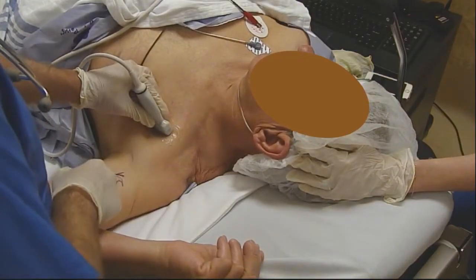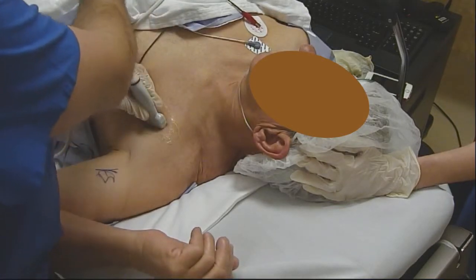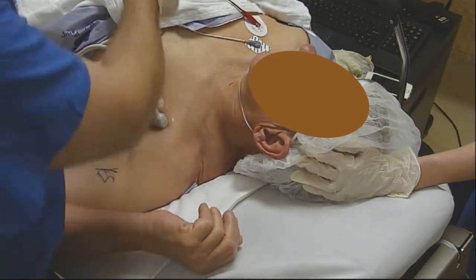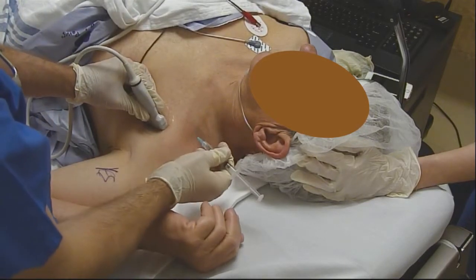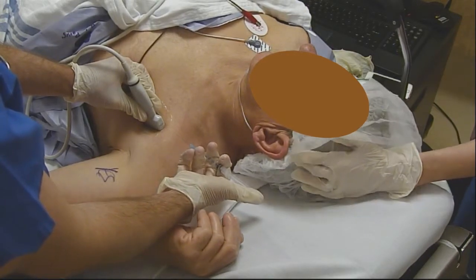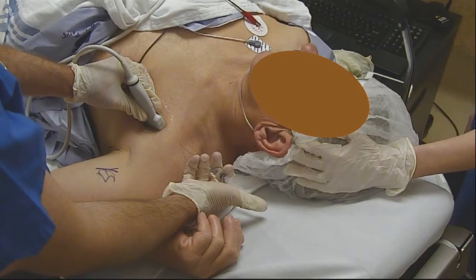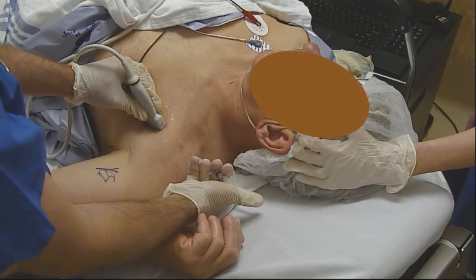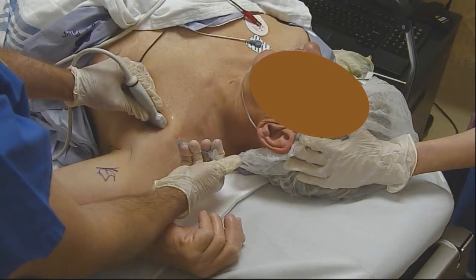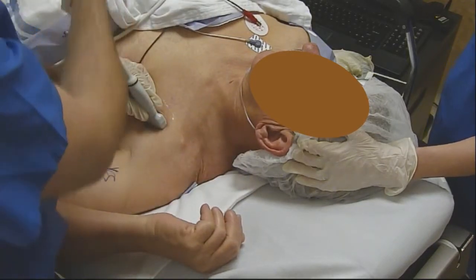Starting at that location where we see the axillary artery with the posterior cord just deep to it, I'm going to clean the skin with chlorhexidine, wipe off any residual ultrasound gel, and insert a little skin wheal of local anesthetic several centimeters away from the probe. This is about a four-centimeter target, so we're inserting a little further away than average for other blocks. We'll actually insert the needle until it's hubbed and infiltrate the track that the needle will ultimately take.